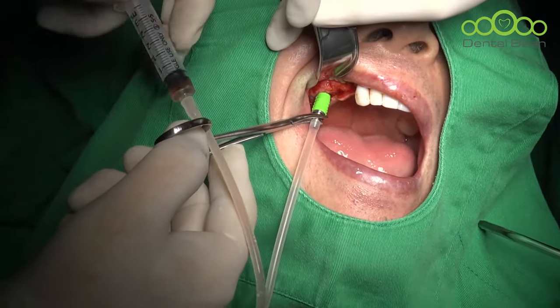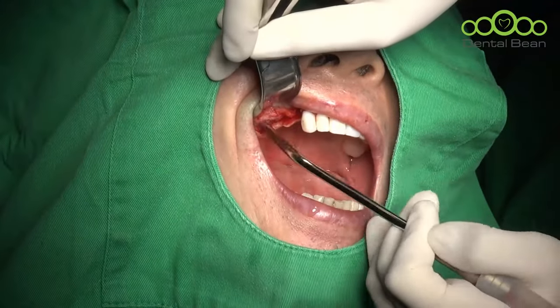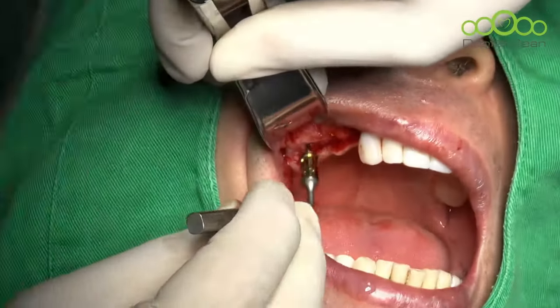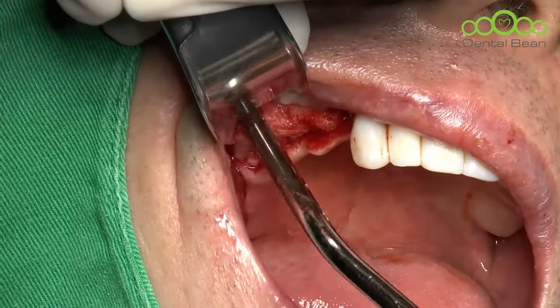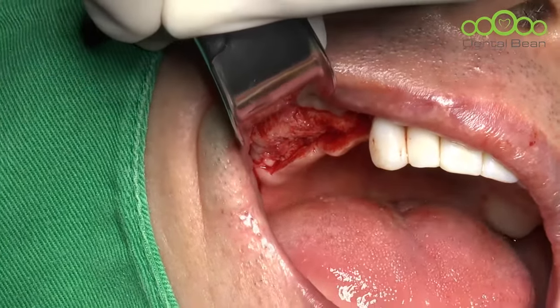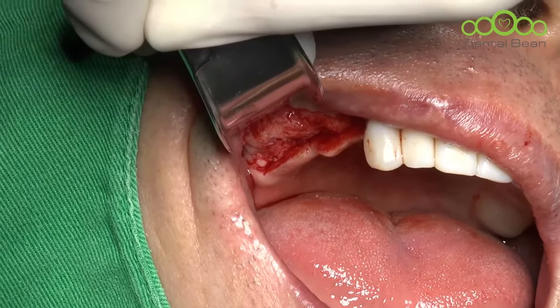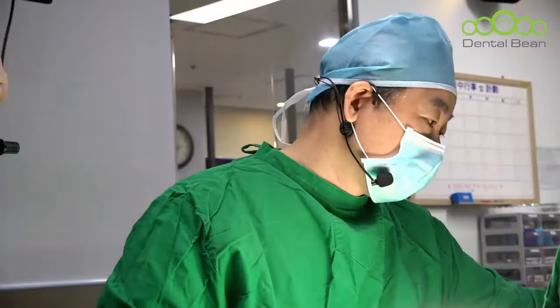So through the first trial, I expect wide membrane separation. Well, this case is a borderline case when the patient has more than 5 millimeter bone height and a narrow sinus. I don't graft. Well, this case is a wide sinus, so it's better to graft something.